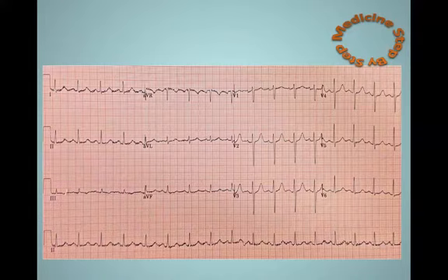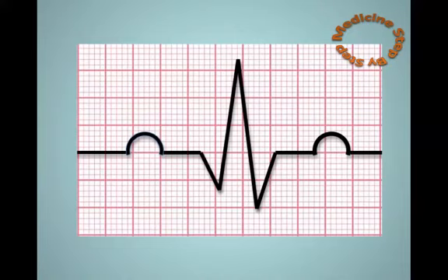The 12-lead ECG looks at electrical activity of different parts of the heart. It then shows a pattern that represents this electrical activity. Let's for now only talk about normal electrical activity. This will be the pattern that you see repeated.